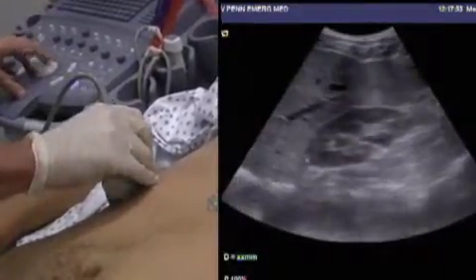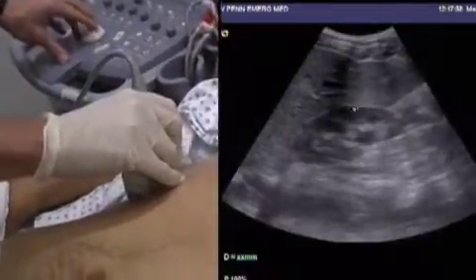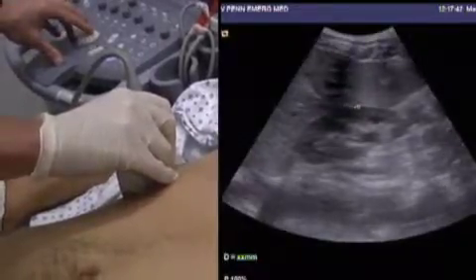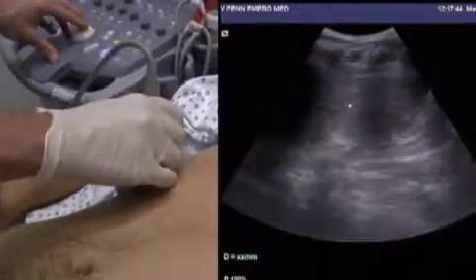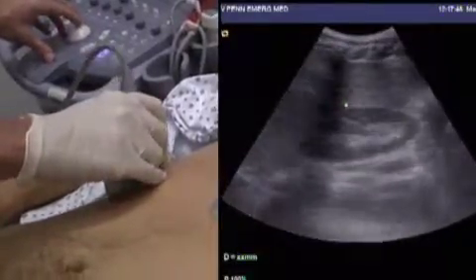Coming back, we immediately identify the superior pole of the kidney here and Morrison's pouch right here, which is the hepatorenal space. We systematically scan from side to side through the entire space to make sure there's not a small collection of free fluid.